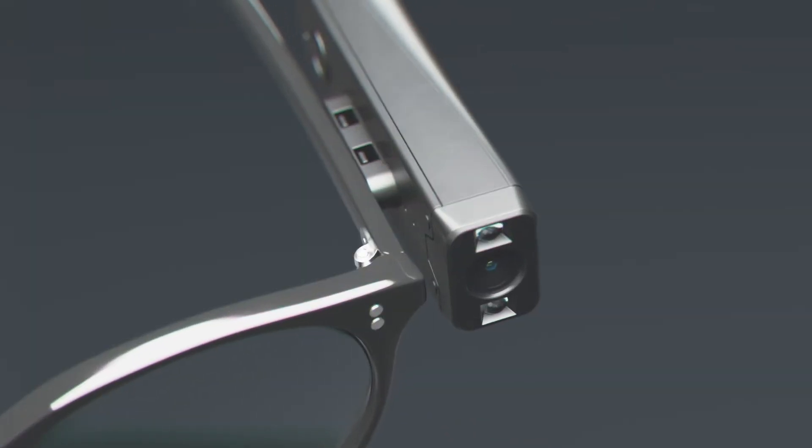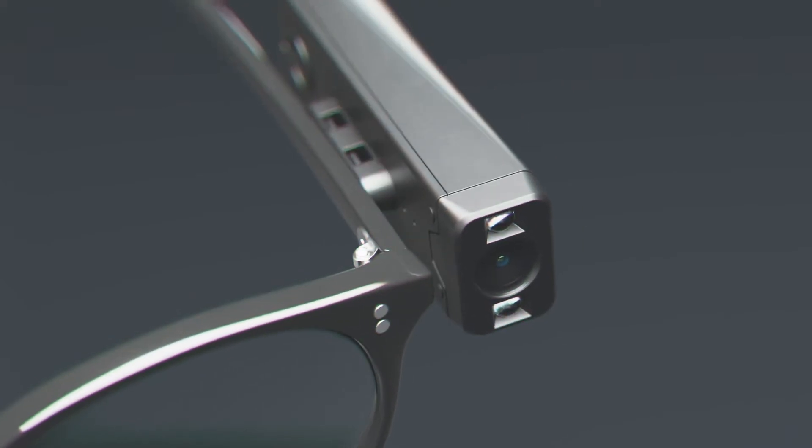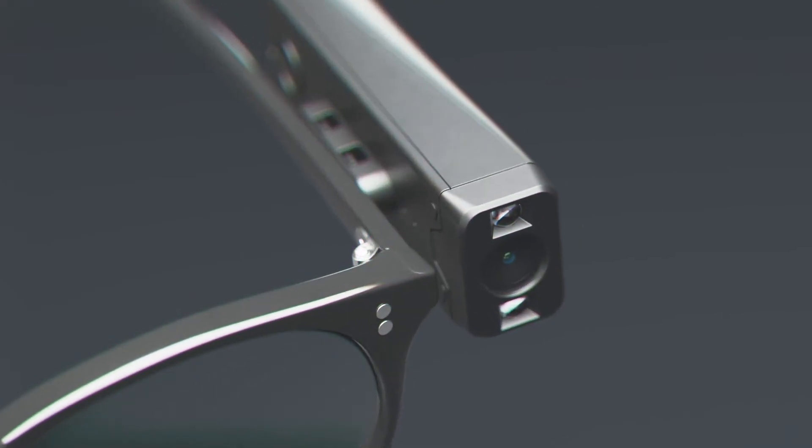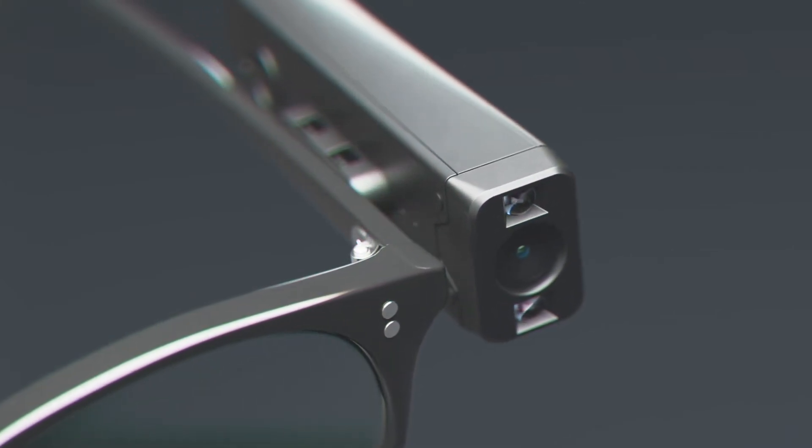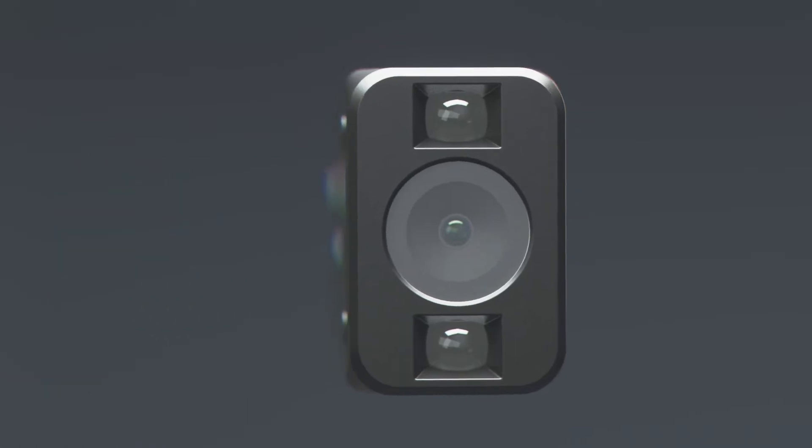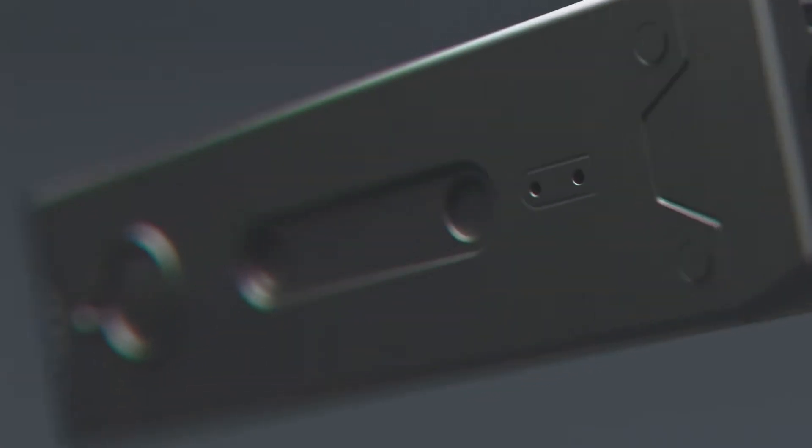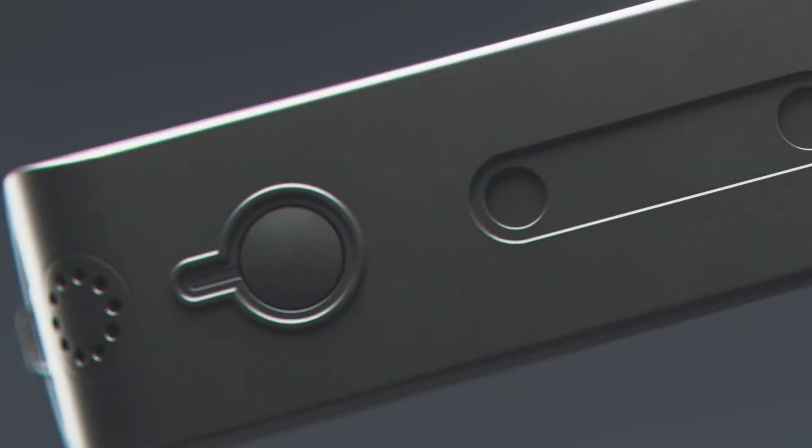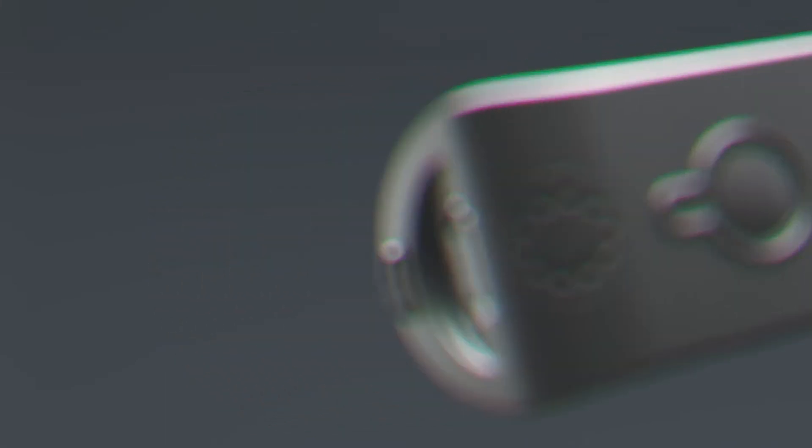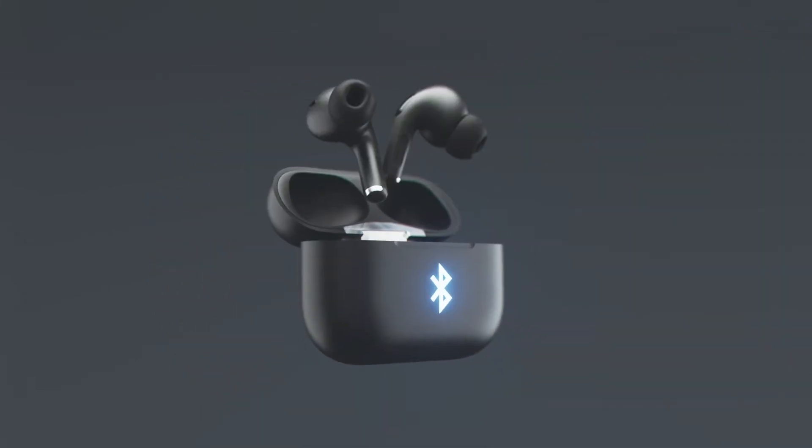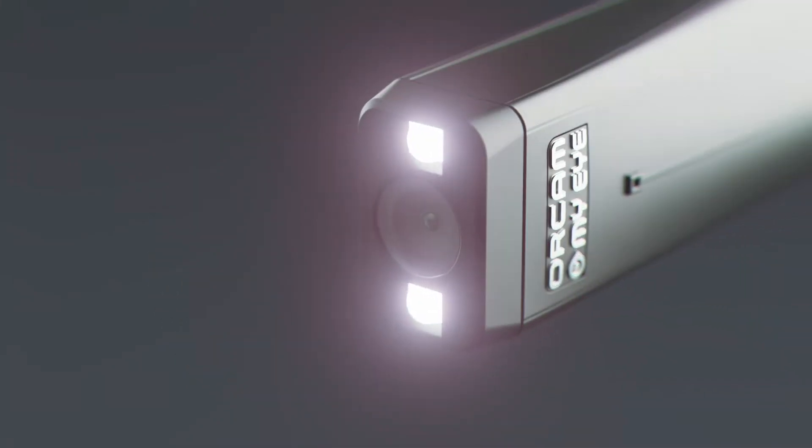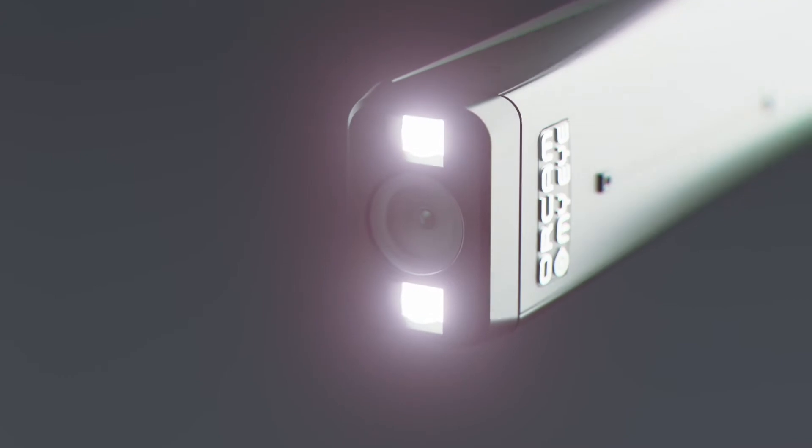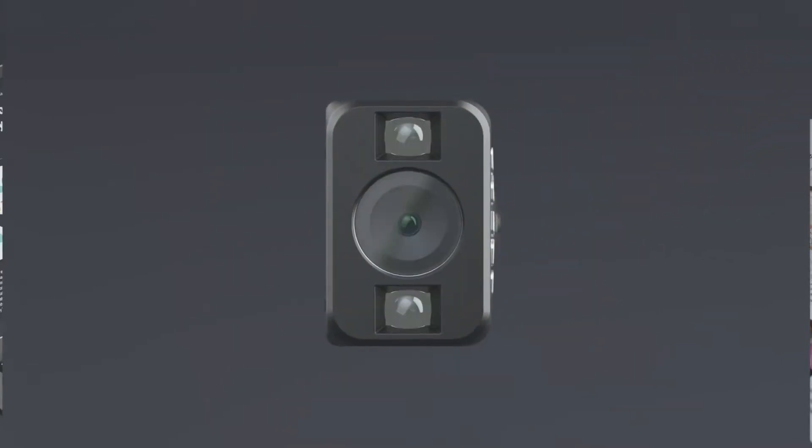The finger-size OrCam MyEye magnetically snaps onto any eyeglass frames for a comfortable fit. The device's optic sensor instantly communicates visual information in real-time through a tiny built-in speaker or any Bluetooth device. In low-light environments, LEDs illuminate the immediate area to allow for continuous operation.